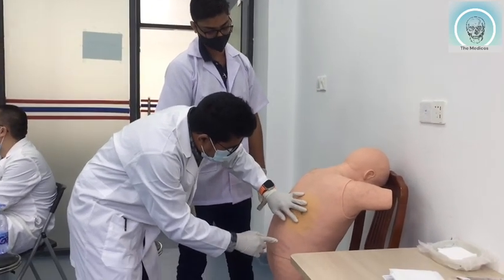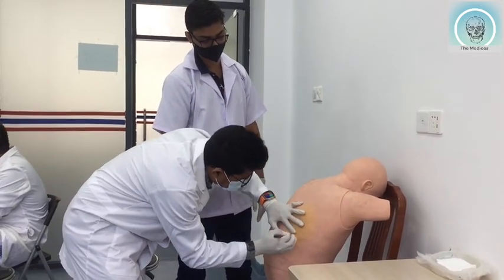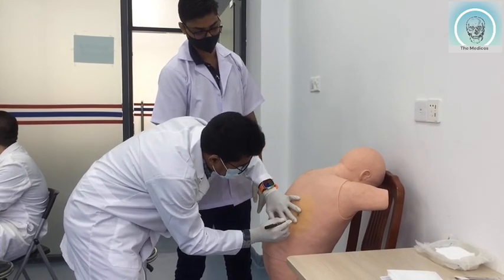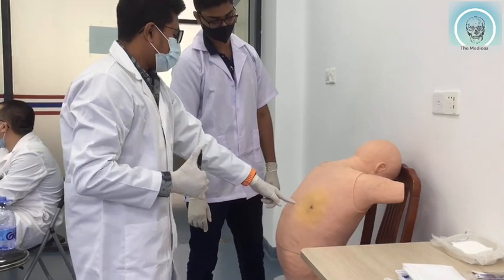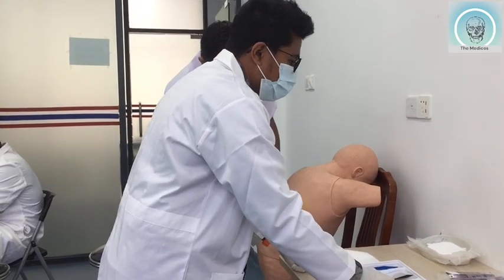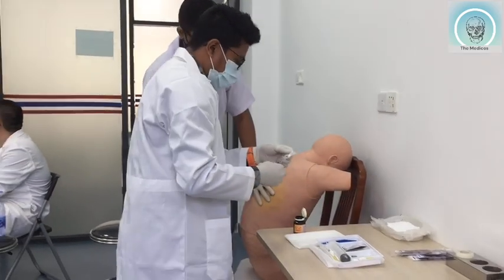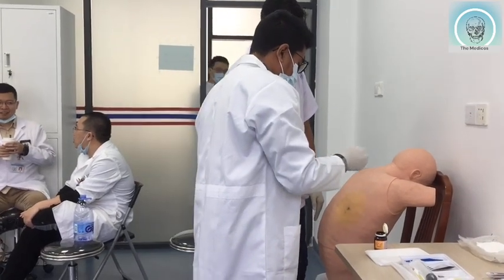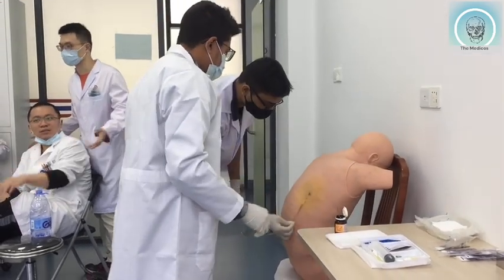Thoracentesis is a procedure used to obtain a sample of fluid from the space around the lungs called the pleural space. This fluid is called pleural fluid and normally exists only as a thin layer in the area between the lungs and the chest wall. However, some conditions can cause an increased amount of pleural fluid to collect, called a pleural effusion. Pleural effusions can be caused by many different conditions, including pneumonia, heart failure, cancer, or tuberculosis. In some cases, blood or other fluid may leak into the pleural space from another part of the body, causing the effusion.